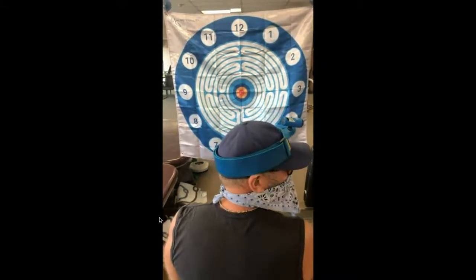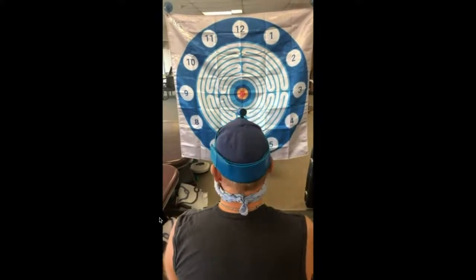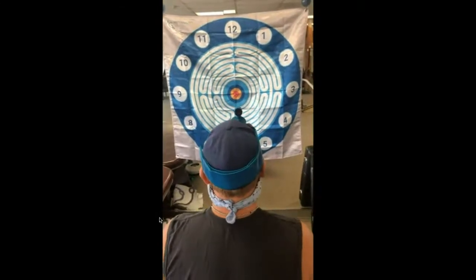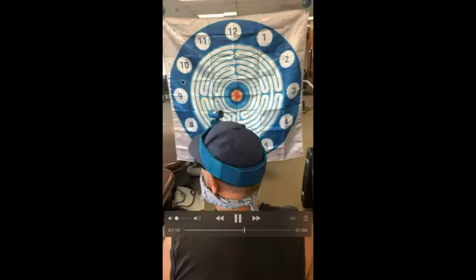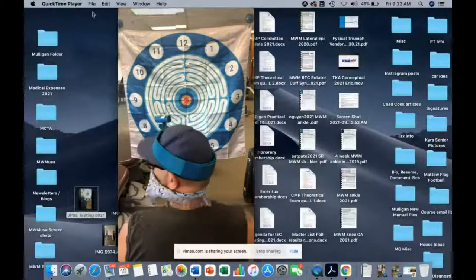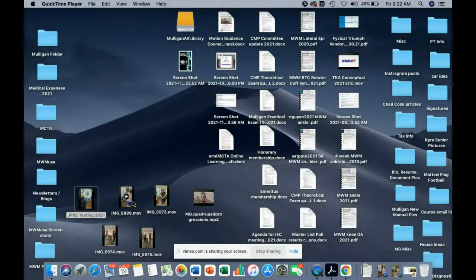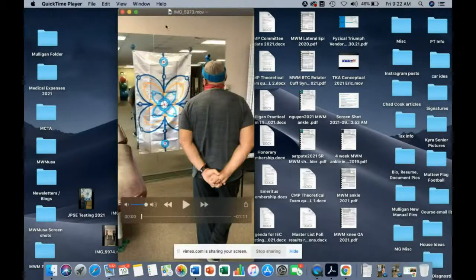If you have 3 trials that are outside the standard deviation, you might as well stop testing there also. Both of those would either be negative or positive for a joint position sense error. Okay. So just a quick review on that, because we've done another live stream. I encourage you to go watch that whole video if you're not familiar with the full testing there. But let's get on to some more dynamic types of testing and treatment applications.